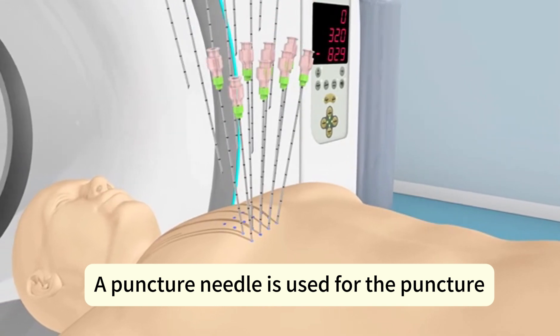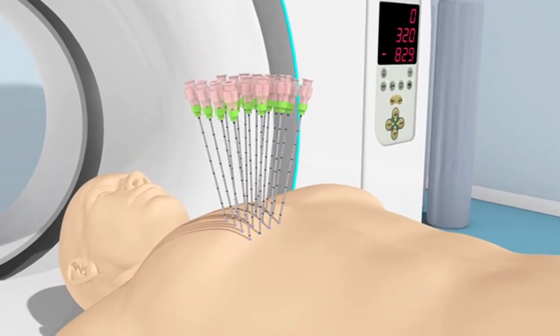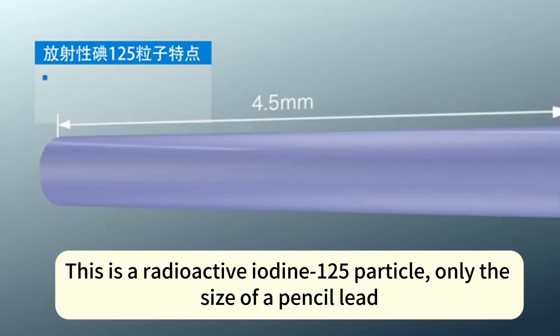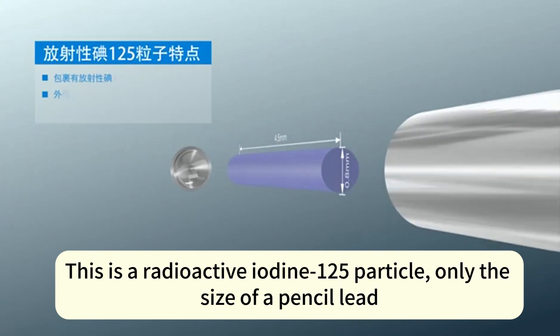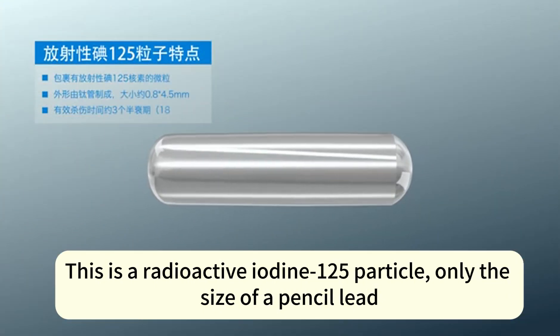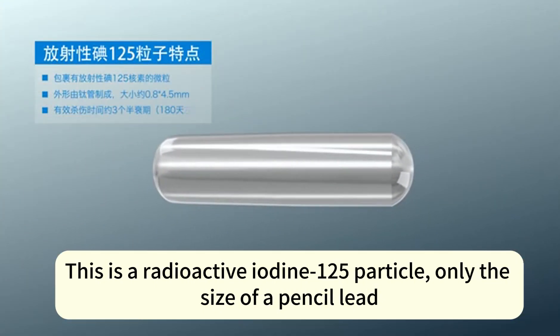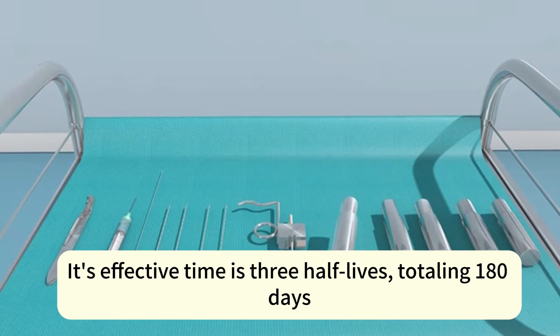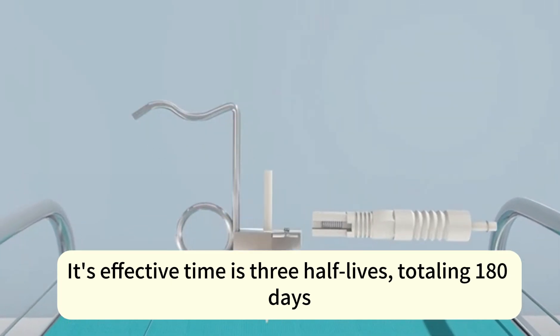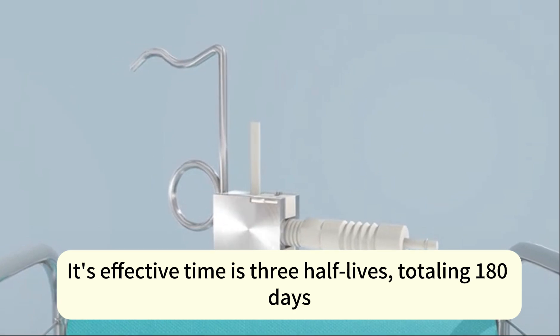A puncture needle is used for the puncture. This is a radioactive iodine-125 particle, only the size of a pencil lead. Its effective time is three half-lives, totaling 180 days.